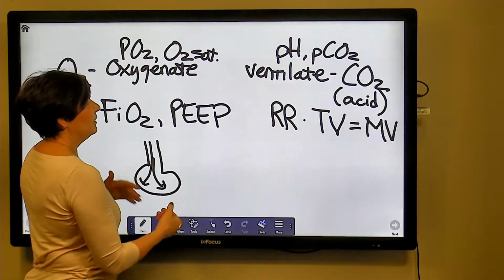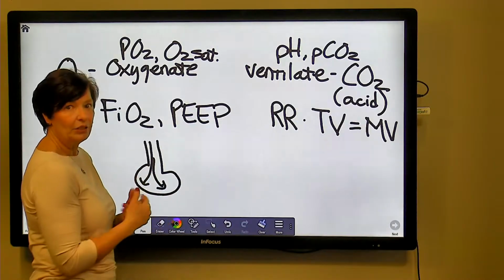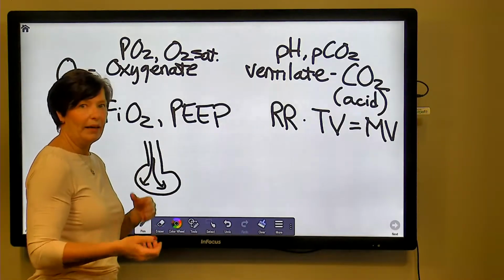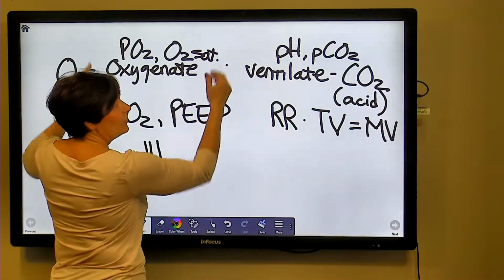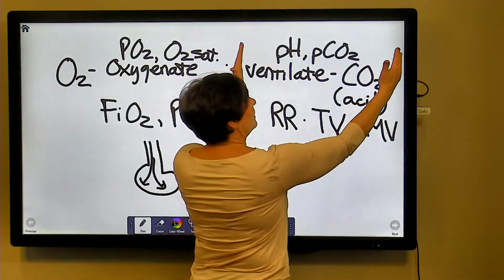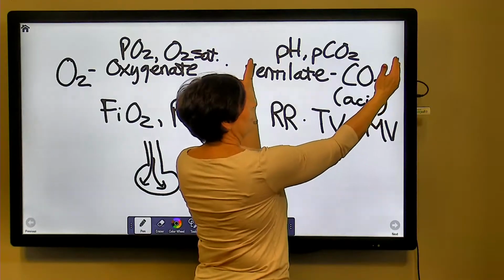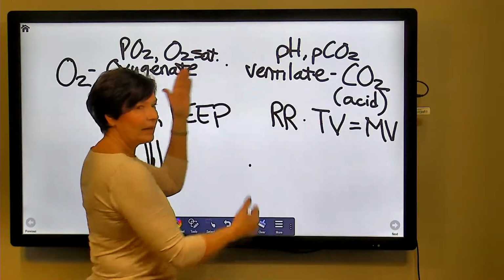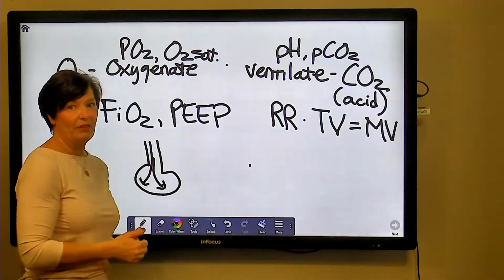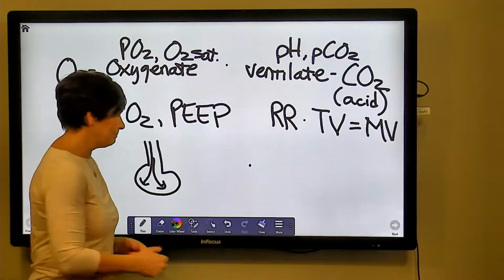Pretty simple. And this also translates into the two common kinds of respiratory failure. I have hypoxic respiratory failure and I have ventilatory failure, hypercarbic failure. And then I just know exactly what I have to work on with my ventilator to make that patient better.